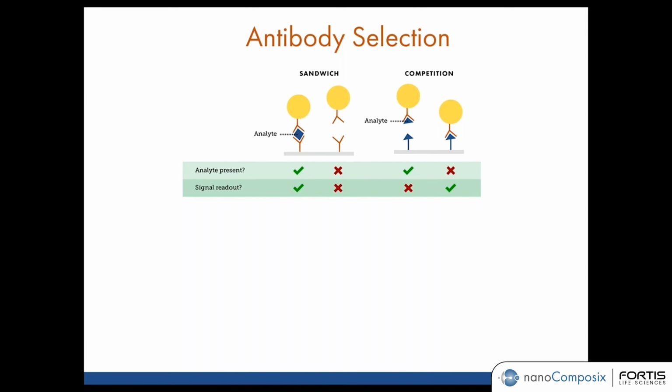This is the main reason why optimization is assay dependent. Because the assay depends on the antibody, and every antibody has unique properties, they will require different conditions to be the most efficient. There are multiple types of lateral flow formats, and two of the main formats are shown here. For both formats, the schematic is showing what would happen at the test line with a positive or negative sample.